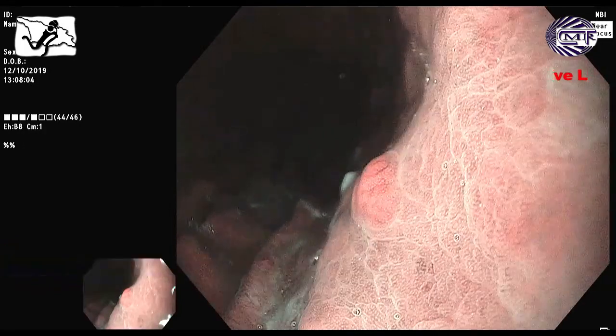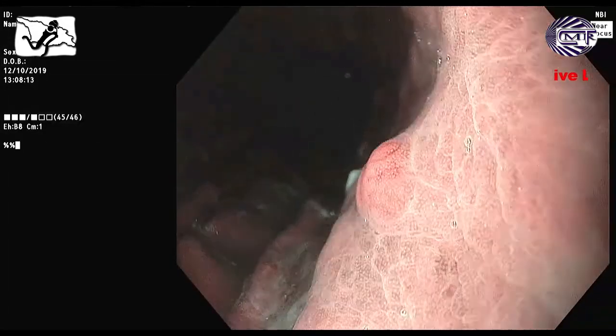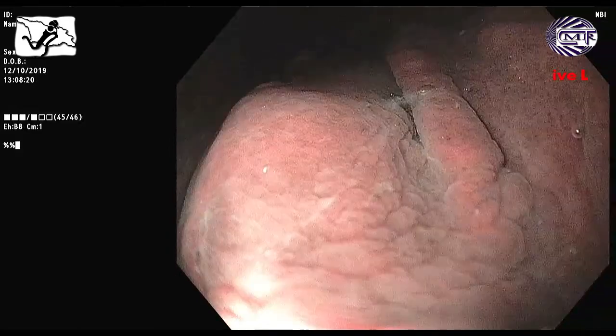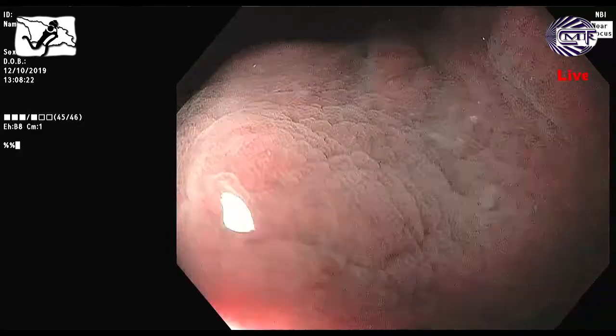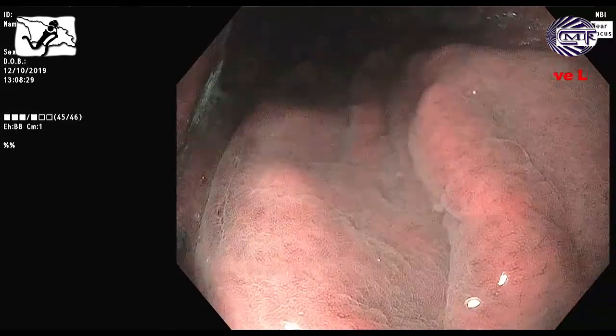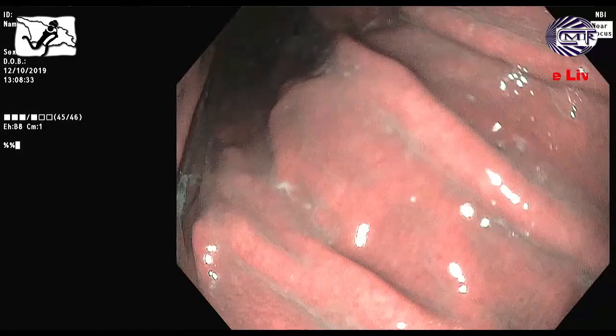For upper GI, I strongly recommend the narrowband image with the B6 or B8 mode and the near focus together, right? Okay. Yeah. And let's go to. This is the chronic atrophic change with the intestinal metaplasia, whole stomach of this patient, right? One of the aging process, right?